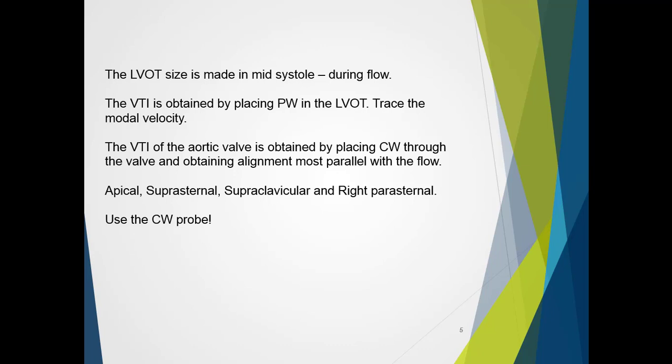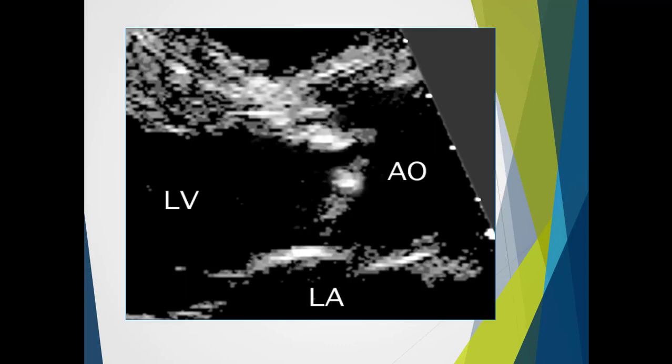Finally, a good sonographer will always use the CW probe for their investigation. It is considered bad form to use the standard imaging probe alone, as the CW probe will always attain the same velocity, if not higher, due to its design and purpose.